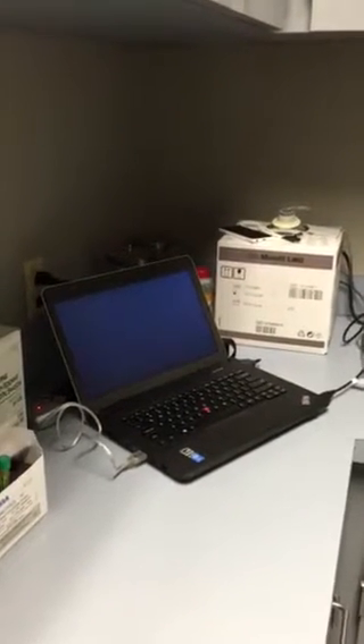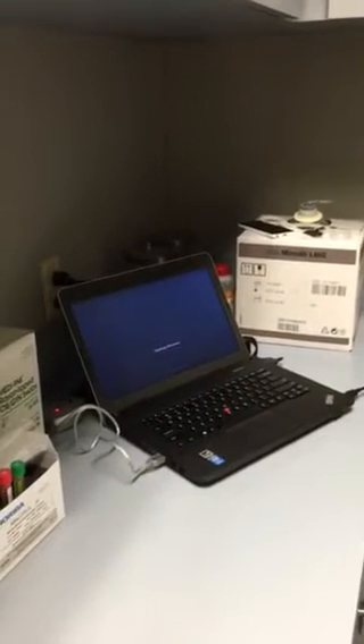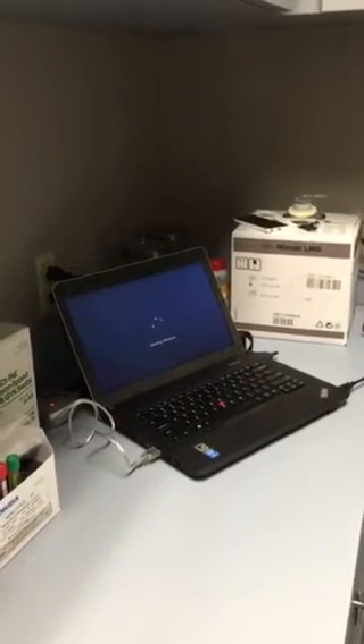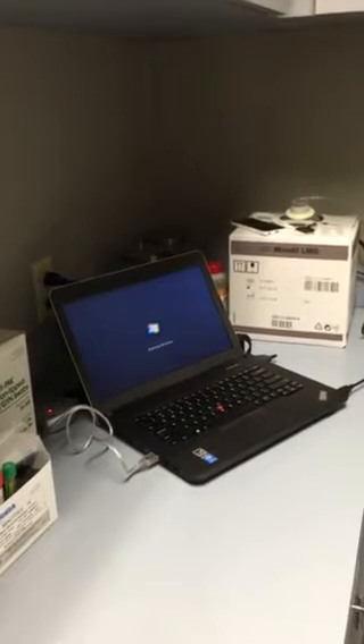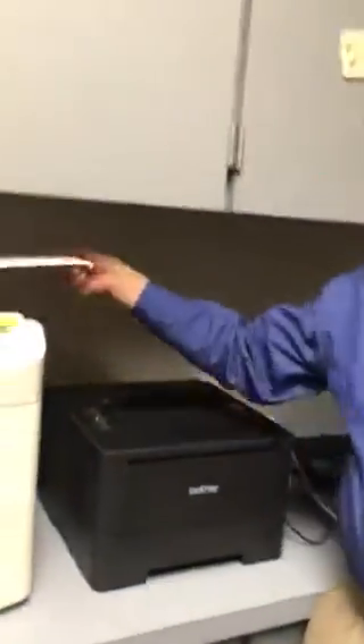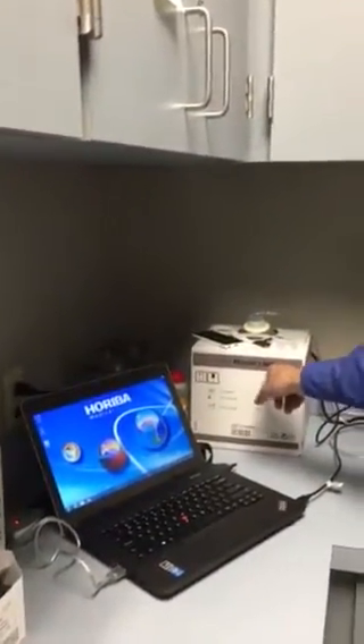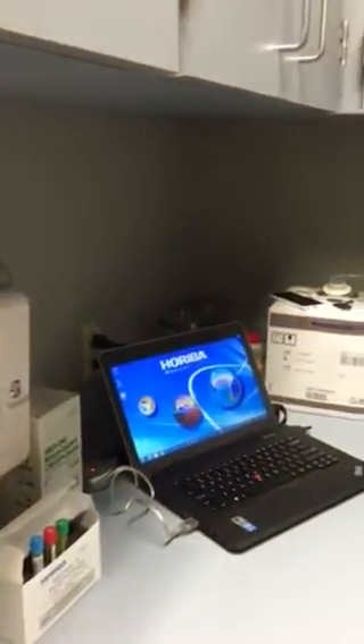Press this button here to turn on the laptop first. At the start of the day you want it ready to receive the startup — that'll be the first thing you'll run when you come in the morning. You have two reagents here: the cleaner and the alpha lise. And then the waste goes out to the sink through this line.